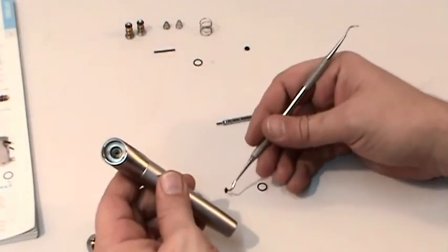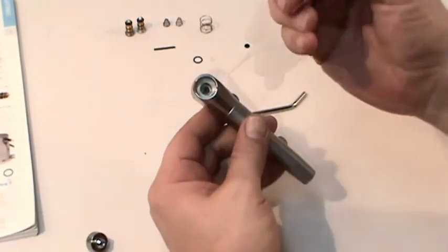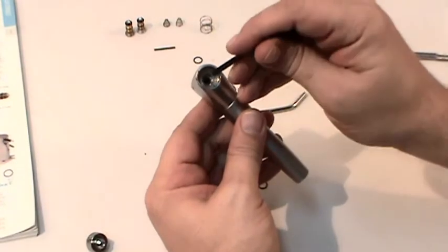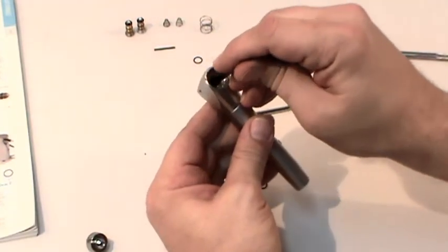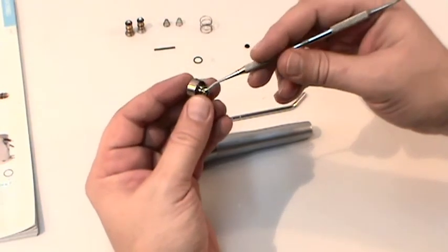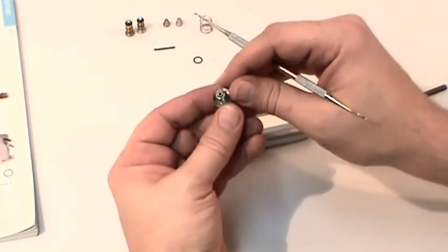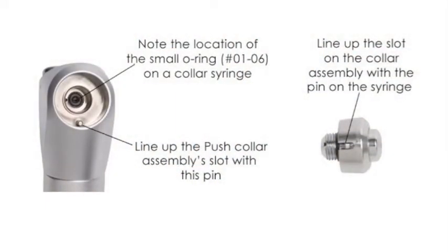Replace the O-rings you just removed with the new ones. Once you've replaced your O-rings, reassemble and install the collar assembly.